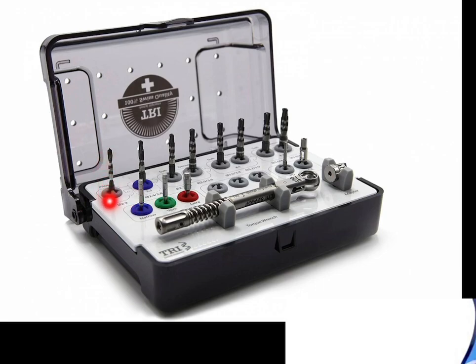And for the placement or marking in the bone, the first and foremost sharp pin we use is called the lance drill. So we start with a lance drill, then we go for the pilot drill, and beginning from this pilot drill, based on different implant systems, the drilling size can be different up till the width of the dental implants.